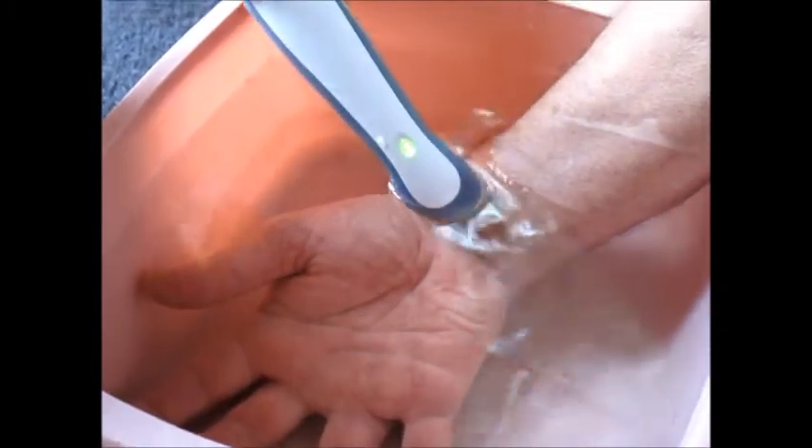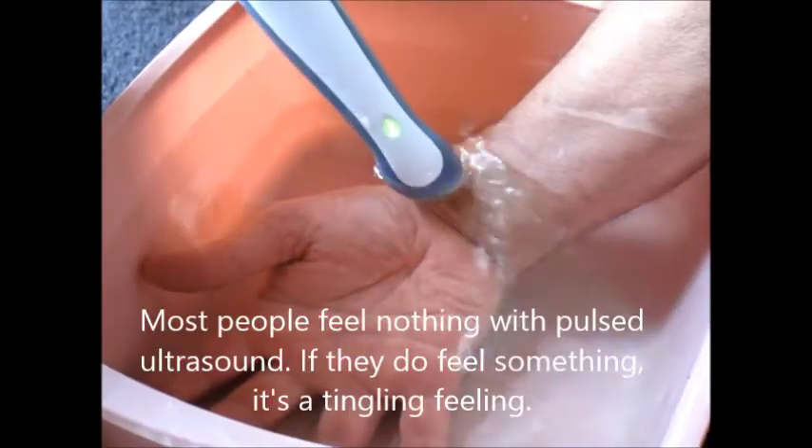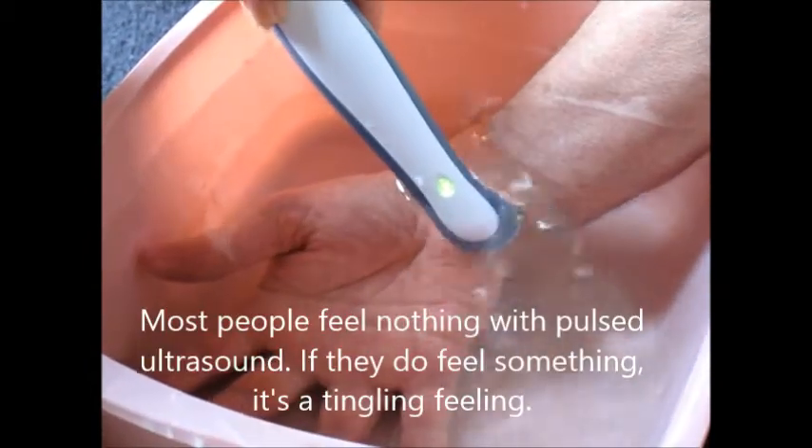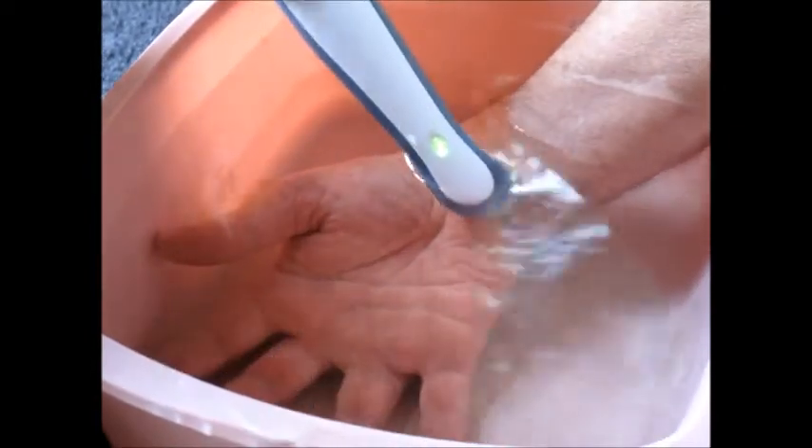Patient: A little heat. It's probably due to the fact that I made the water kind of nice and tepid, so it's not usually from the pulsed ultrasound that he'll feel the heat. Usually people feel a tingling feeling and a little pins and needles thing.